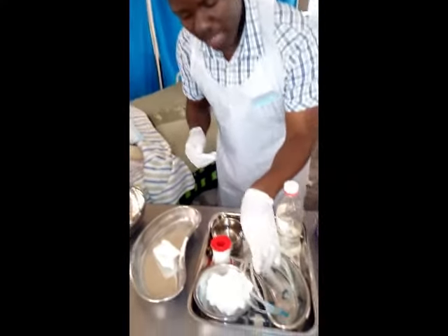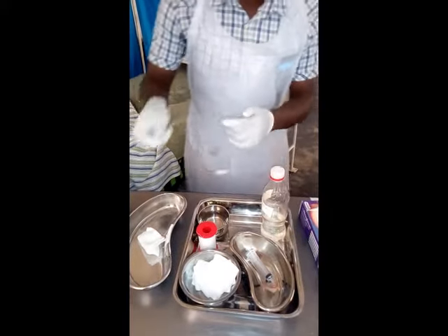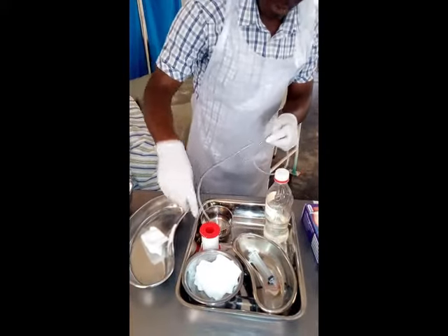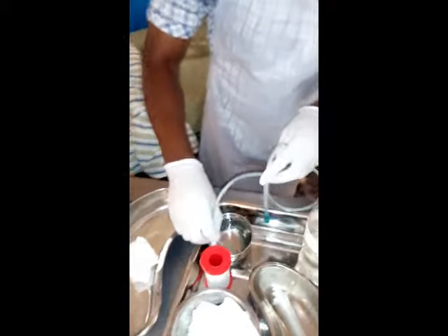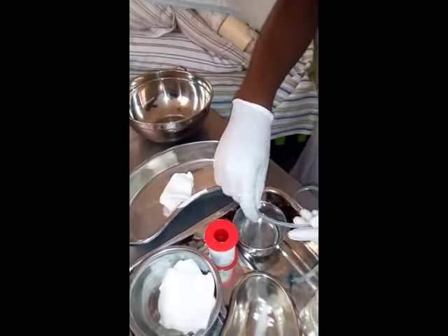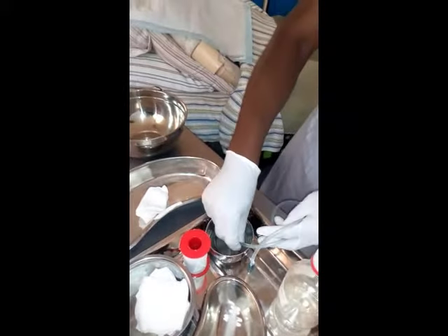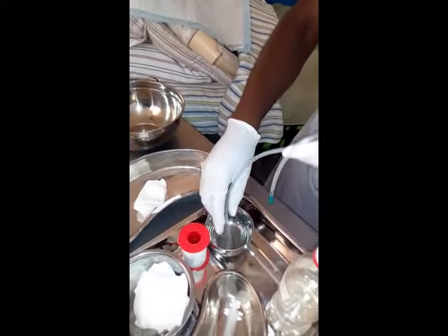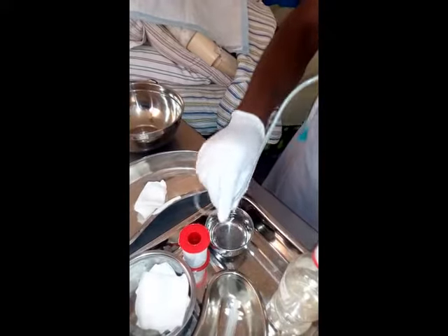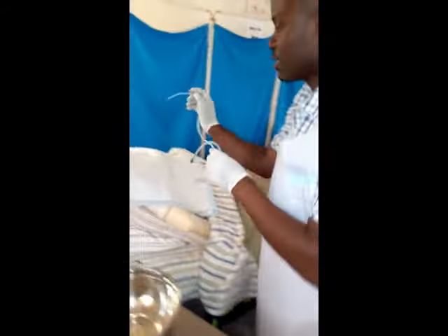Then you go back to your tube, and you have to put it in water, cool boiled water, just for lubrication. So just like that. Where you find KY jelly, you can use KY jelly, there's no problem. But where you find cool boiled water, you can use cool boiled water. But in an exam, I want you to use cool boiled water. So after having lubricated, you go to the patient.